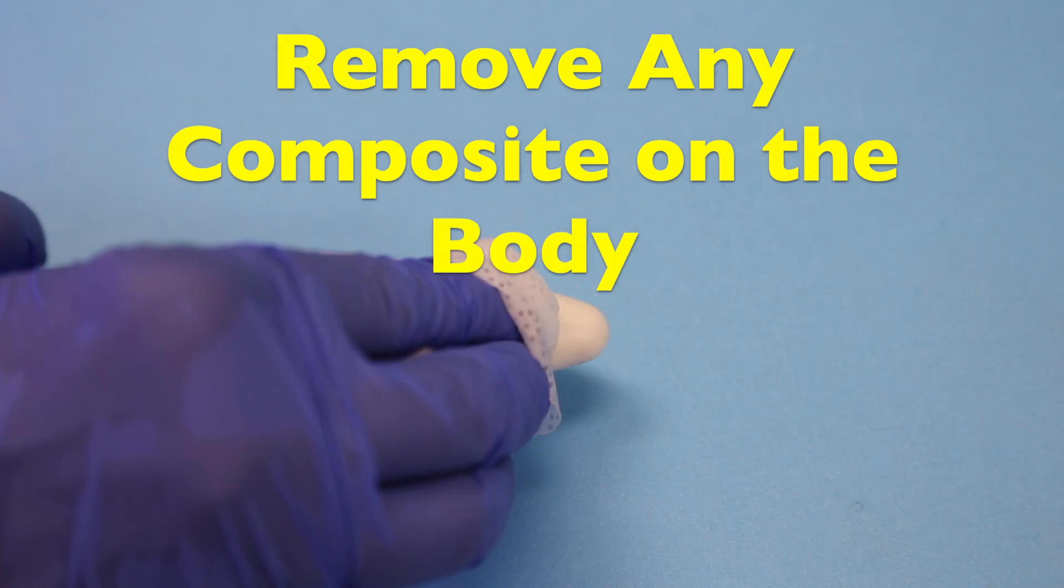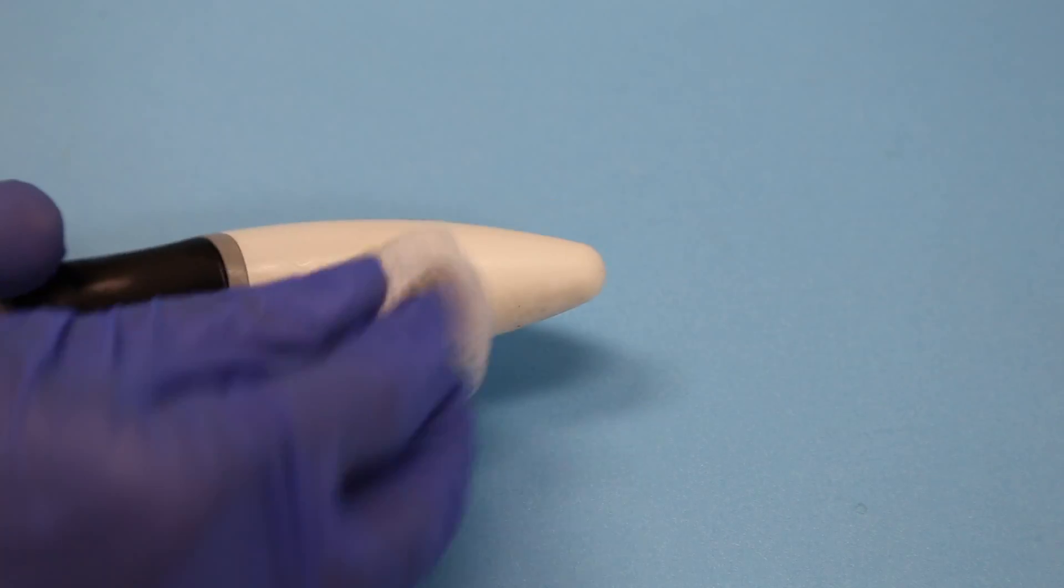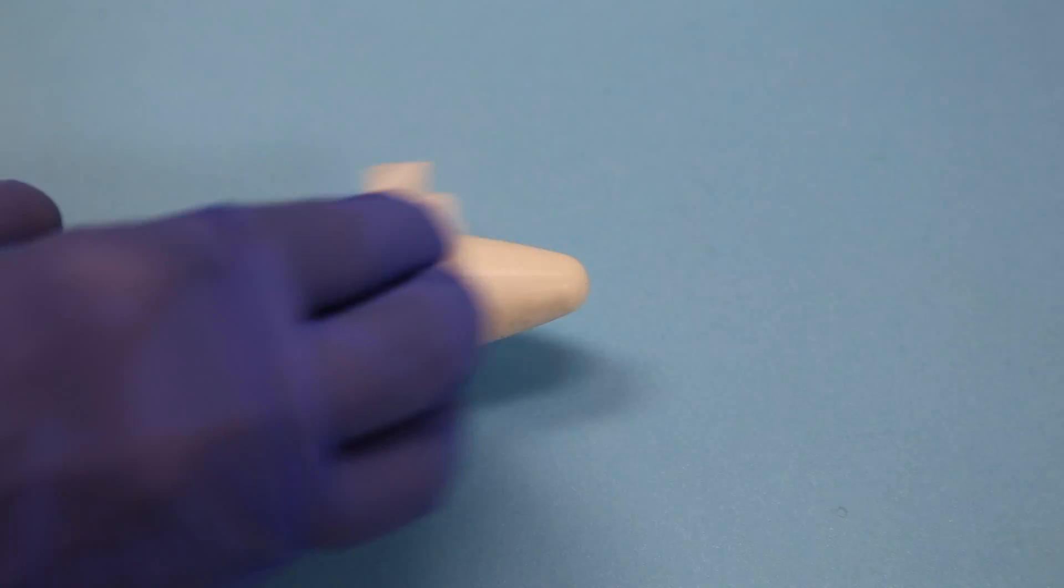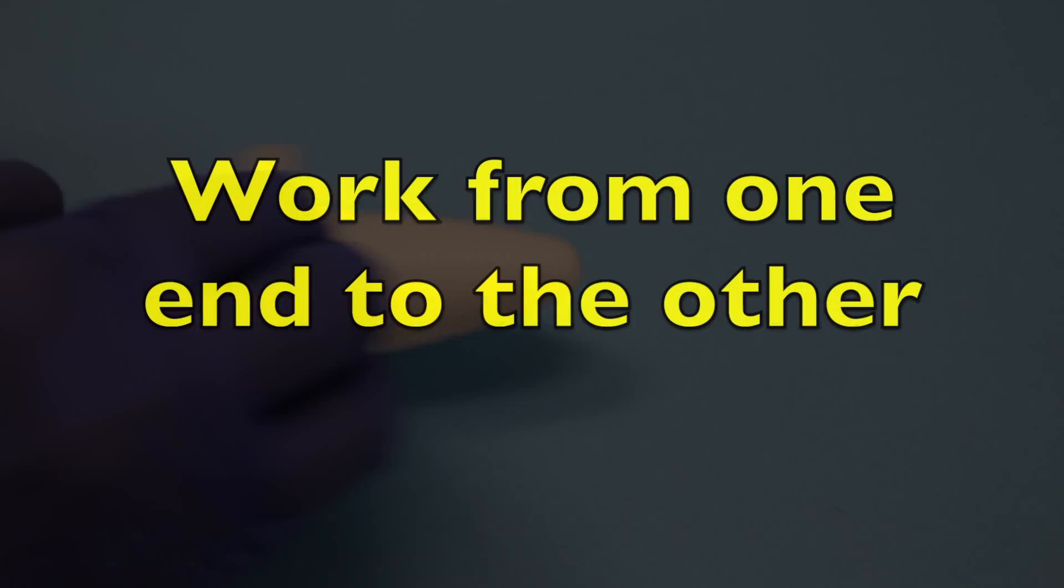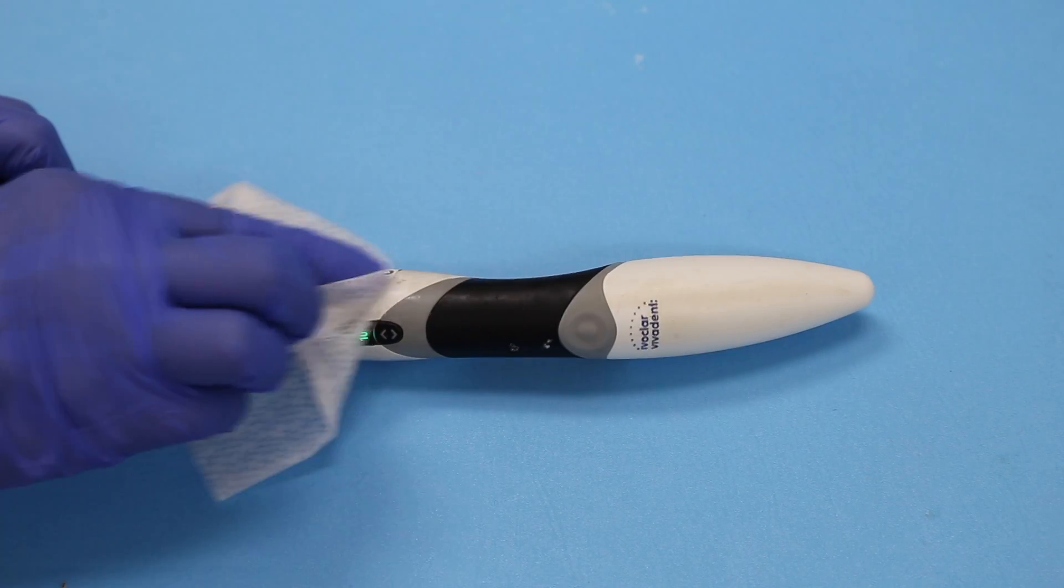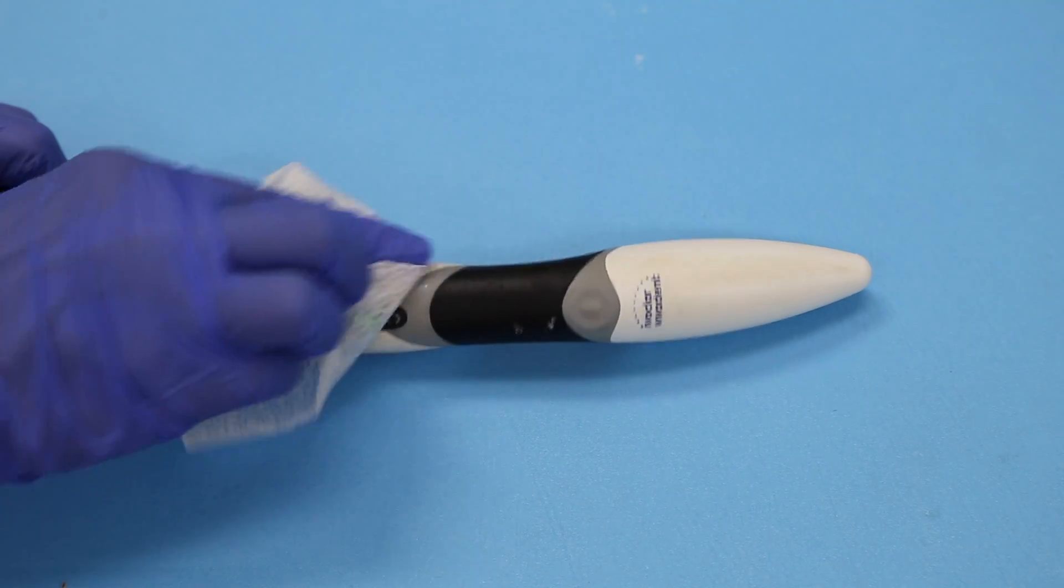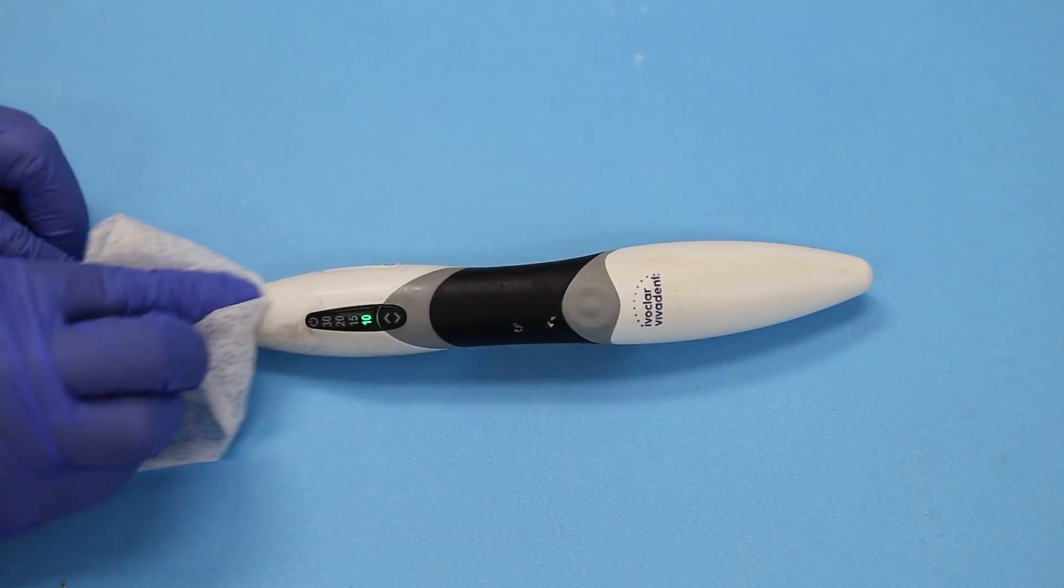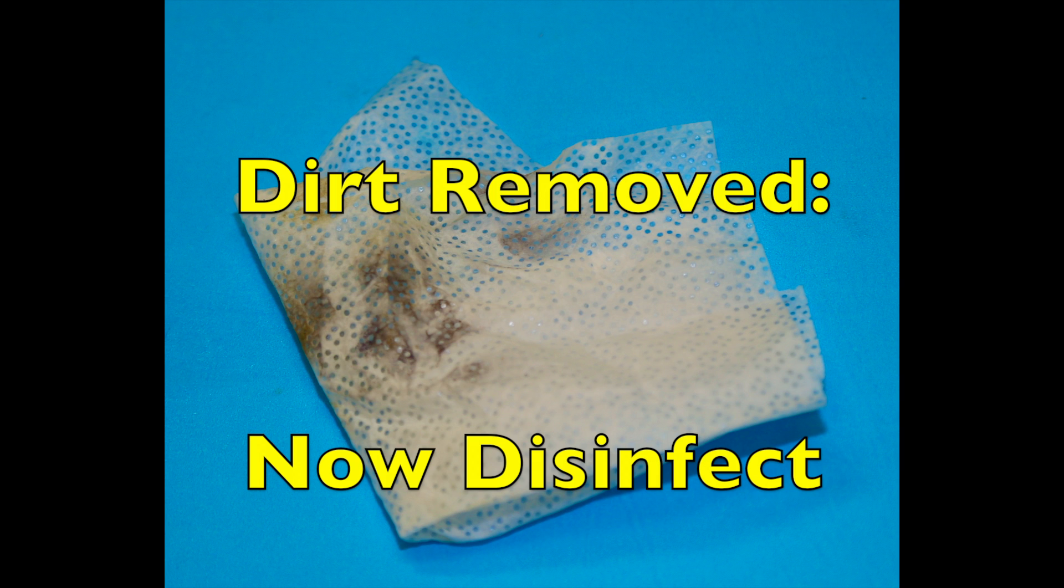If there's any composite on the body of the light, then we just rub the surface a little bit harder and usually the composite just comes right off. Work methodically from one end of the light to the other. Pay careful attention around the buttons and also around any joint areas where debris may have collected. Look at the debris that was removed from this light.